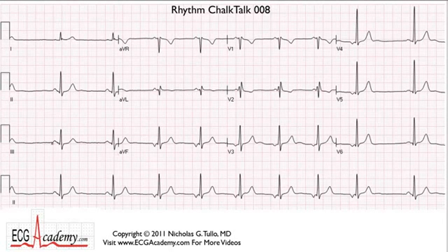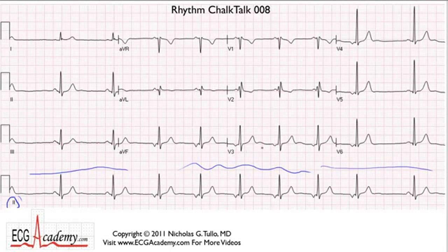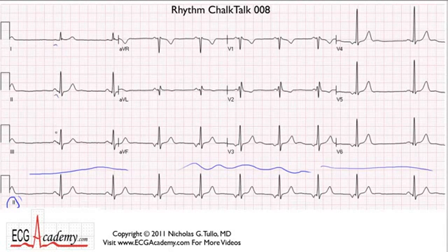This is a bit of a departure from my usual rhythm strip because I'm showing you the whole 12-lead, but down here there is lead 2, which is a rhythm strip. You can look at the whole forest and see that it's a little slow in the beginning, then seems to speed up, and then gets slow again at the end. Examining these ECG beats in detail, we can see an upright P wave in leads 1, 2, and 3, a normal PR interval of about 160 milliseconds, and the QRS complex and T wave look pretty normal.